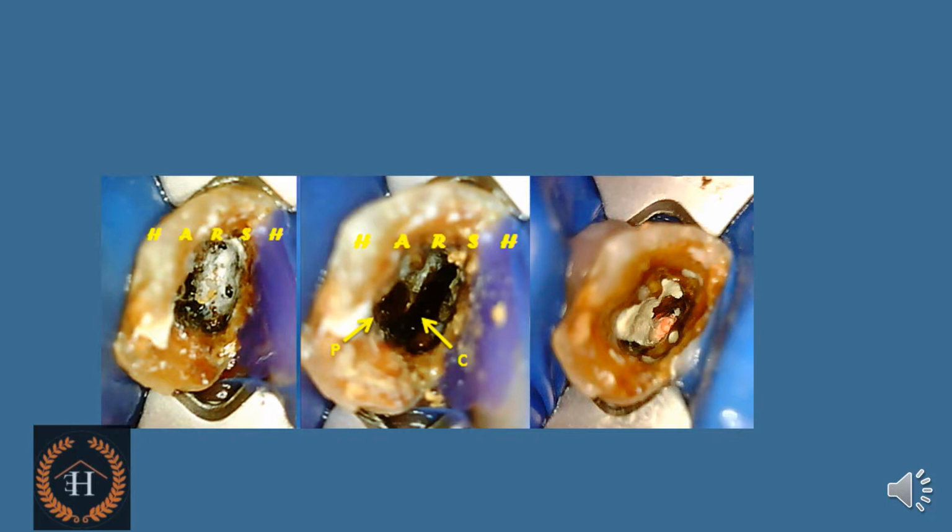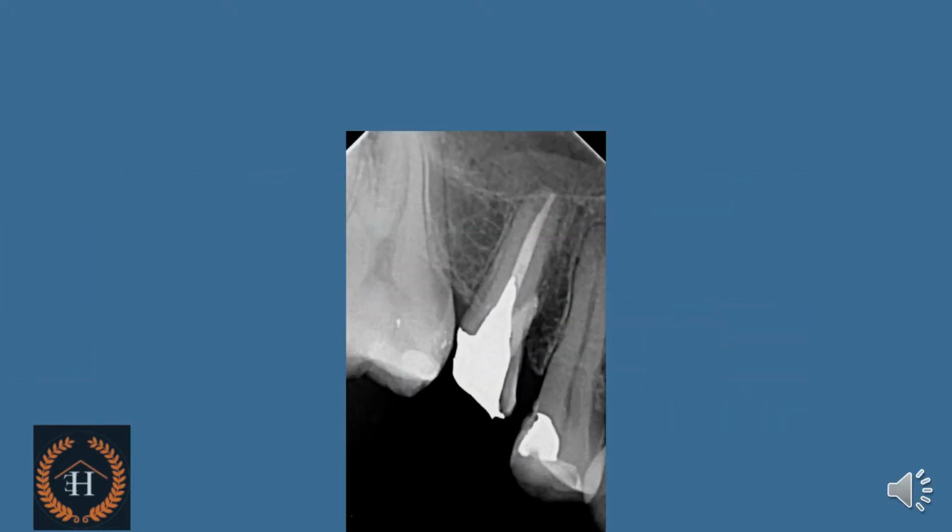Once the wall is formed, the entire endodontic access cavity was filled with amalgam and allowed to set. After the amalgam was set initially, the thin band of resin matrix was removed with an explorer.